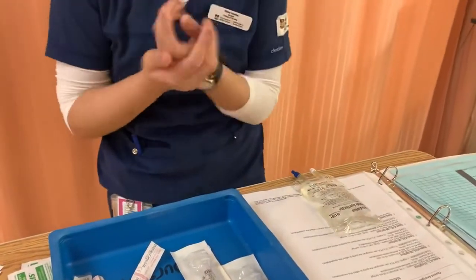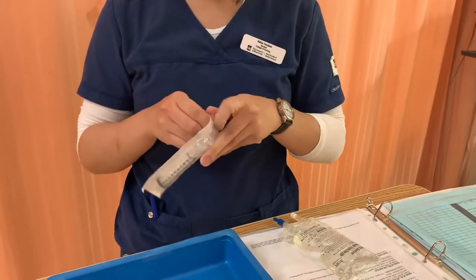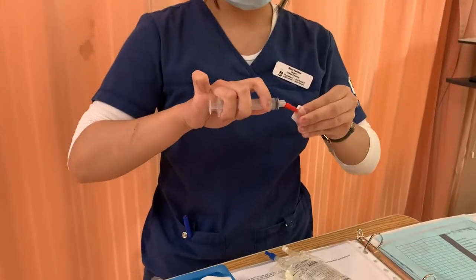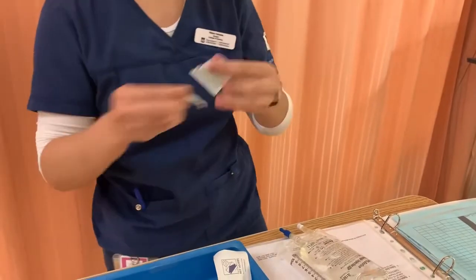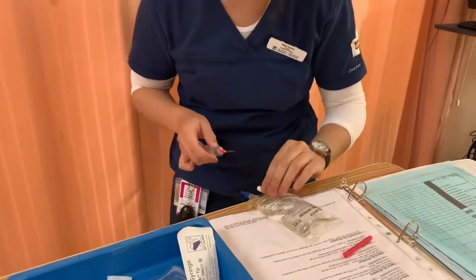So wash my hands again. Now I have my syringe right here. Open that. While maintaining sterility, I have my blunt fill needle right here. While maintaining sterility, I'm gonna put that in there. And I have my alcohol swab. Gonna clean it for 30 seconds, let it dry for 15. And I'm gonna draw my 5 mLs.